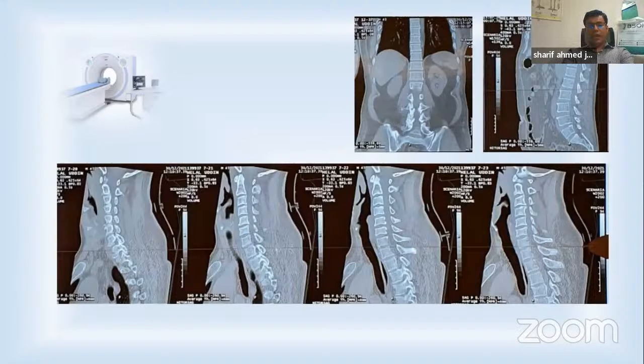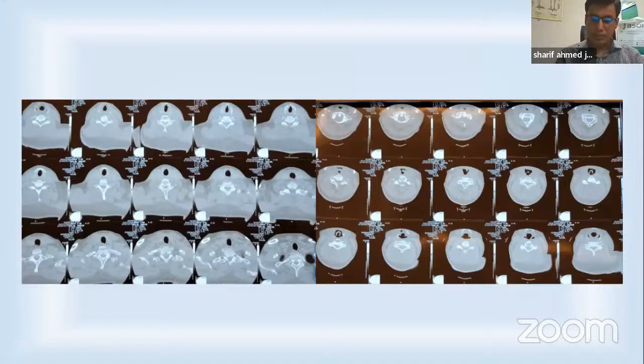As it is not conclusive, we have to go to CT. If you carefully look at the CT, this is the sagittal as well as the coronal plane, there is nothing contributory. There is only some OPLL, but a very small amount, at the C5, C6 level. And the axial section is not contributing anything. But the patient is quadriplegic, and both the X-ray and CT are not conclusive.